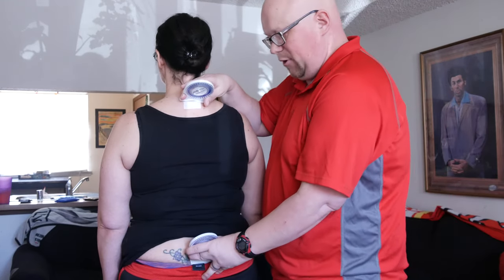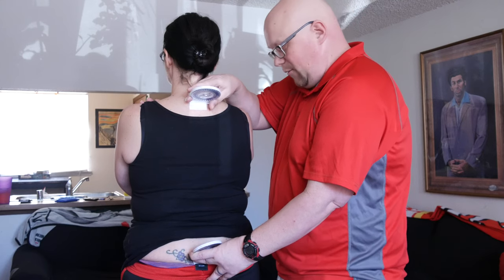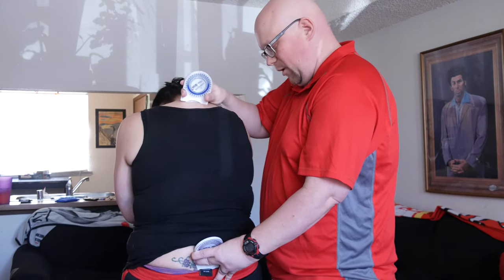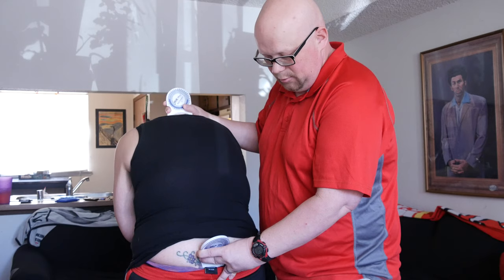Then I'm going to have her lean forward like she did for flexion. Go ahead and have them cross their arms across their chest and lean forward just like you did for flexion. Go as far as you can without bending your hips. You can kind of help them along with this.